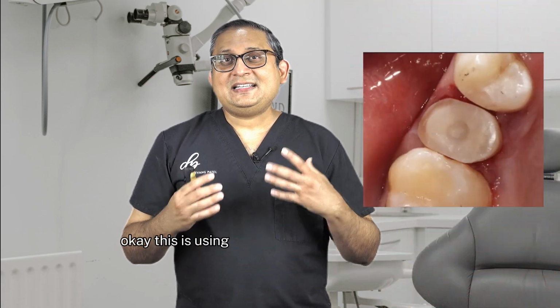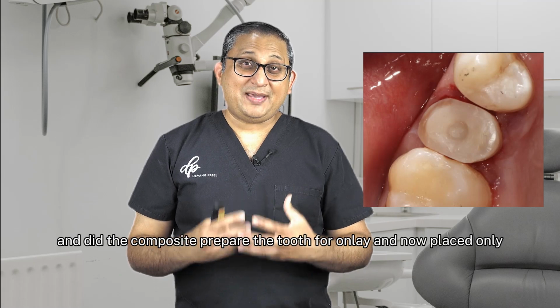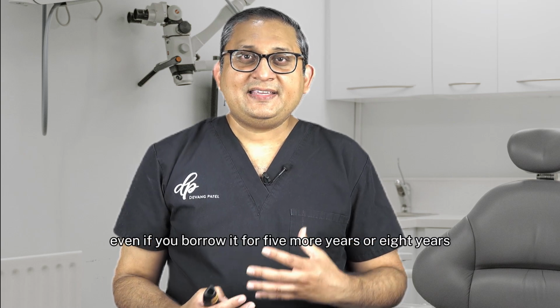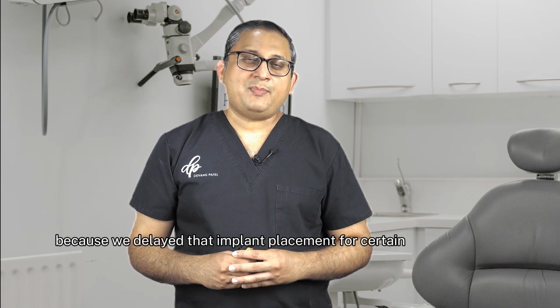This is using the deep margin elevation technique. I did the composite, prepared the tooth for an onlay, and then placed the onlay, and the patient's really happy. And I'm sure this is going to last the patient a considerable number of years. Even if we borrow it for 5 more years or 8 years, it's still a success because we delayed that implant placement for a certain amount of time. So this is really deep margin elevation, where you want to restore the tooth, but the margin is subgingival.